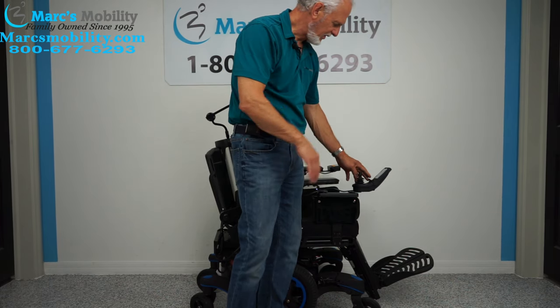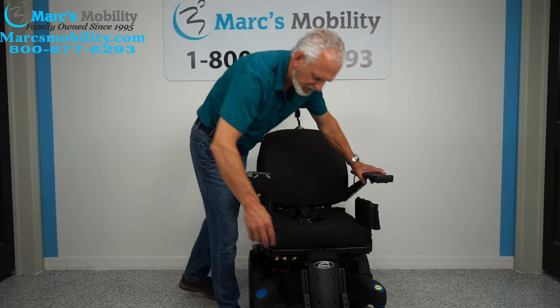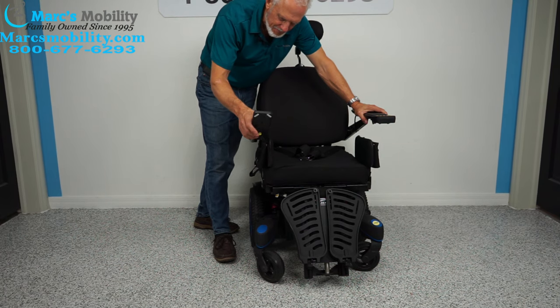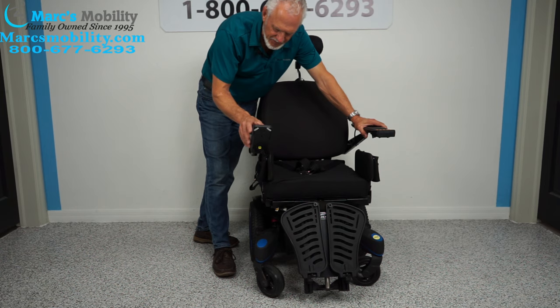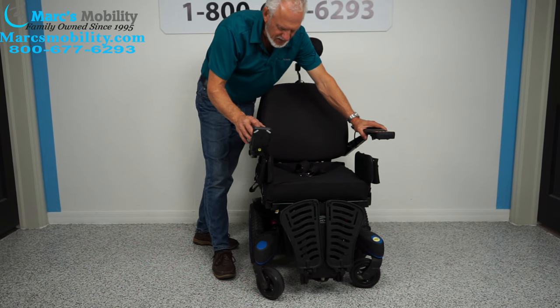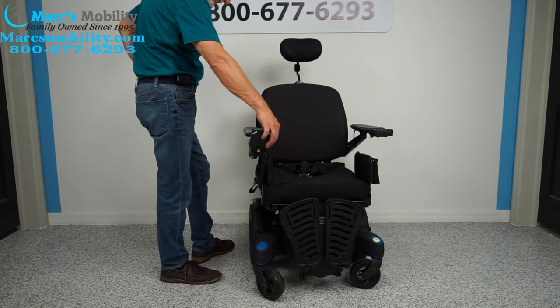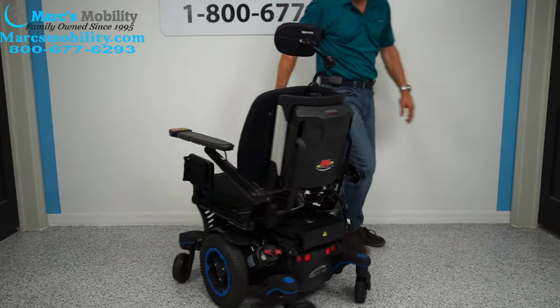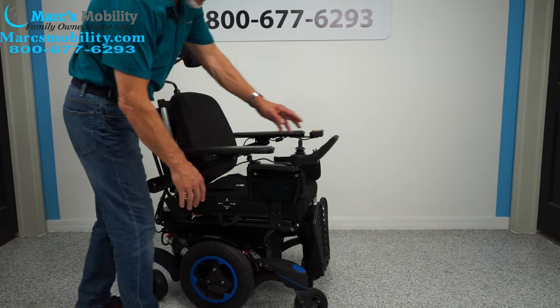Let's put the chair back in drive. Note that on some joysticks you go one way and on others the opposite direction. The footrests fold up. Because this is a mid-wheel drive chair, it has the best turning radius — you can see right here exactly how it turns inside your house.